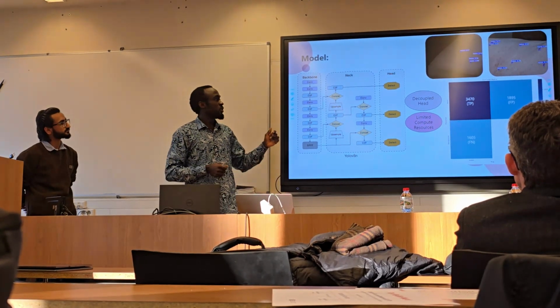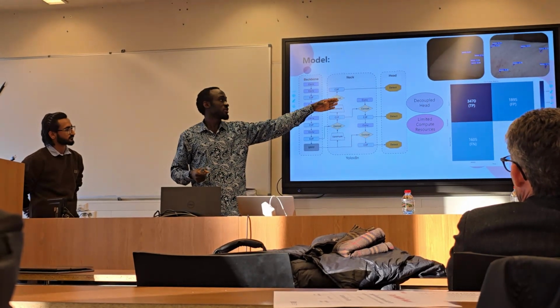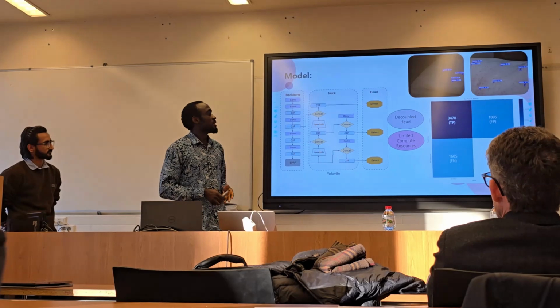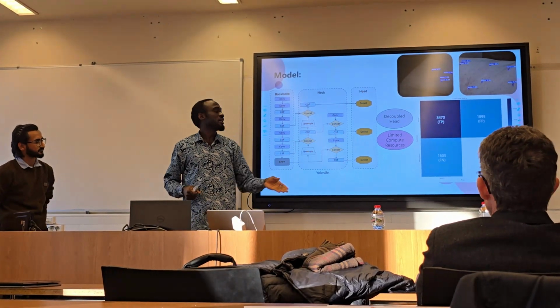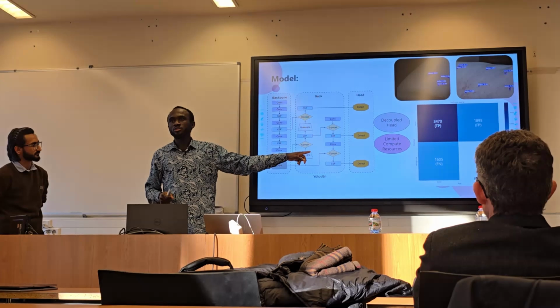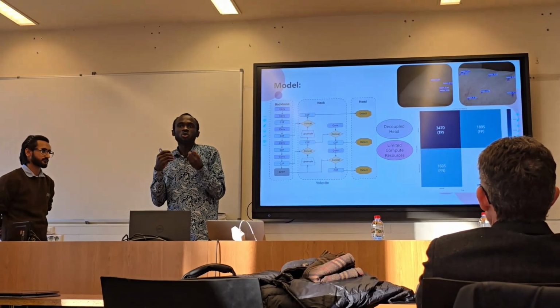As we can see, we have about 3,470 images that the model predicted as lesions which are actually lesions, and about 1,600 of them that the model says are not lesions, but meanwhile they are lesions, which is very bad, because for this kind of scenario we are concentrating more on this.